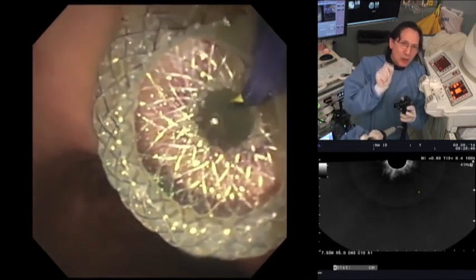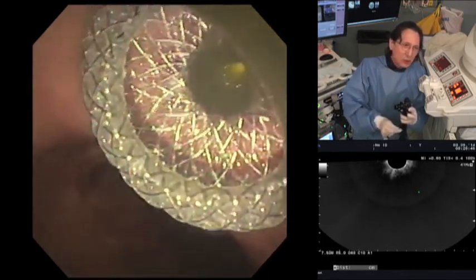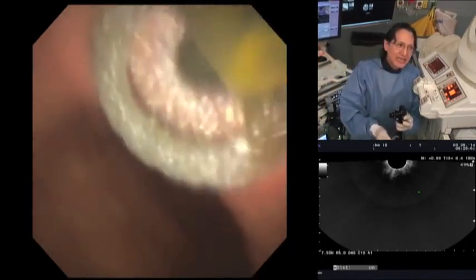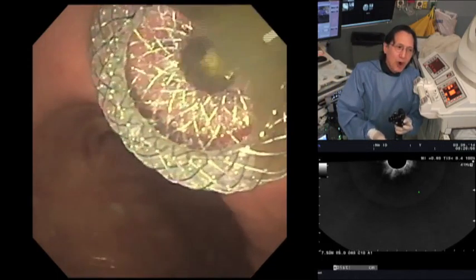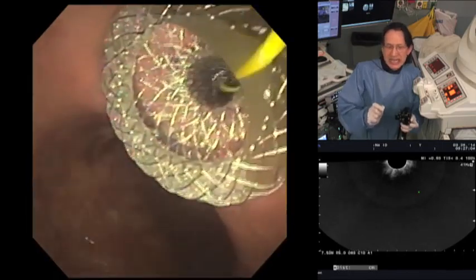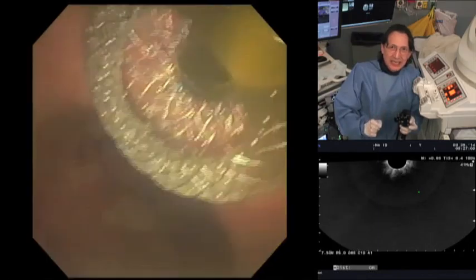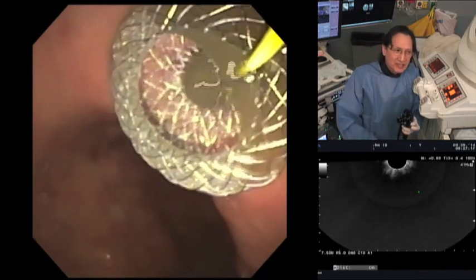That's the tip. That nose cone, by the way, on the hot AXIOS has two wires that run on the side. Those are two cautery wires. It's not like the cystotome that has a metal ring on the tip. It's got two wires, and those two wires allow you to penetrate through the wall without any collateral cautery damage to the tissue. So you basically don't even see a burn mark. The cautery is just to allow you to get into the cyst very easily. So it's cautery that's almost unnoticeable. And it also allows you to get in very easily.